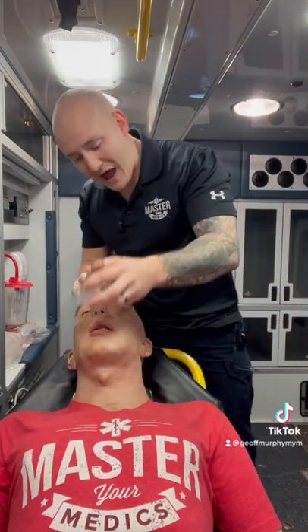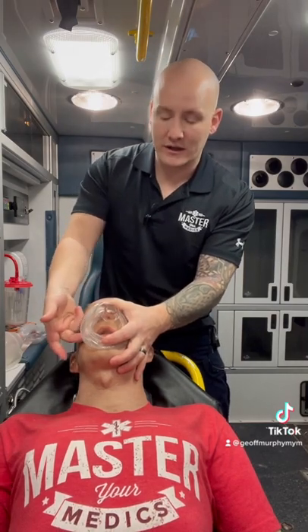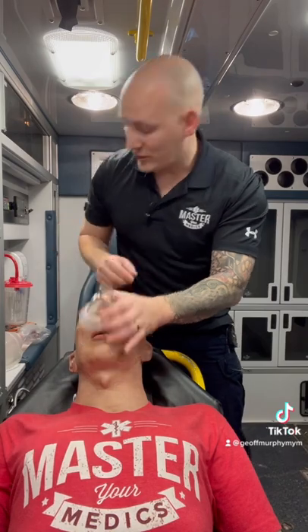The next thing is holding the mask at a higher position. A good rule of thumb: the lower position we hold on the mask, the more likely our grip is going to be offset, creating a leak on one side. The higher we hold the mask, the less likely we're going to be offset, meaning less chance of a leak on the opposite side. That's two.